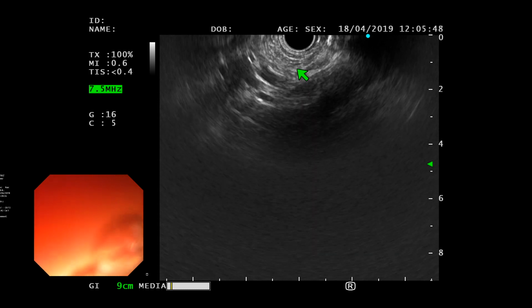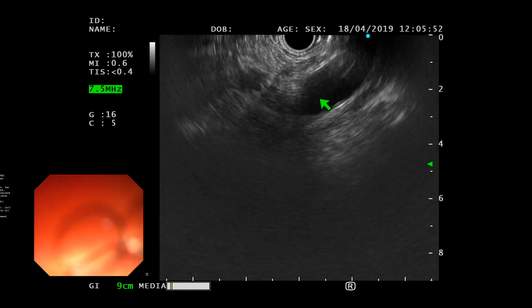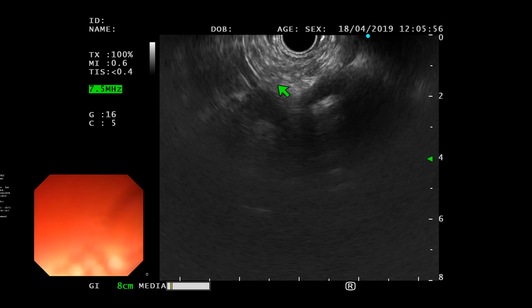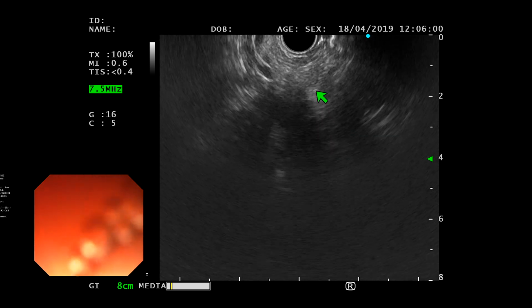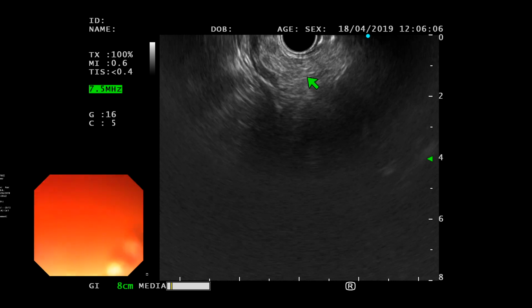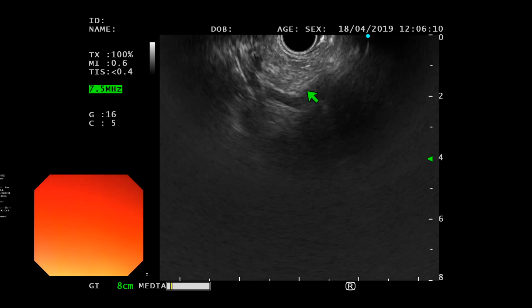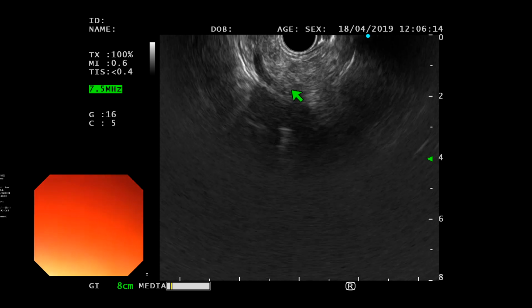You have your pancreas. See that? So now you go clockwise. I'm going to just make this a bit bigger. Okay. So this is the pancreas. We had the pancreas. I don't know if we lost it, but relax a bit. Come back and again, there you go. That's your pancreas. Now relax your big wheel and go counter, so away from you. Keep going, big wheel away.